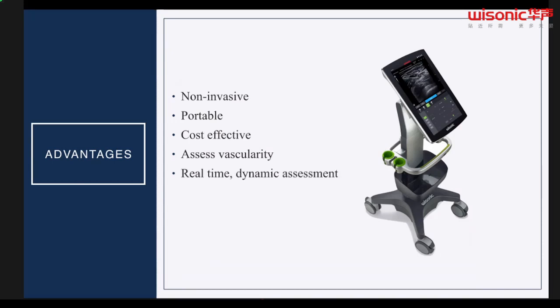Like I said, you can get real-time assessment and evaluation, and this is critical because you can see some pathology, and then based off of what you see, you can do another scan if you need to. You can get imaging right on the spot. So you have that image right away versus sometimes you have to wait hours to get an MRI, get CT scans, things like that. And then let's not forget, it's very safe.